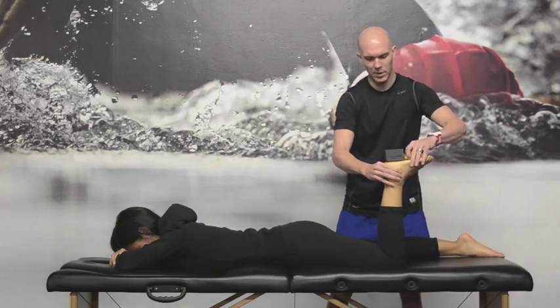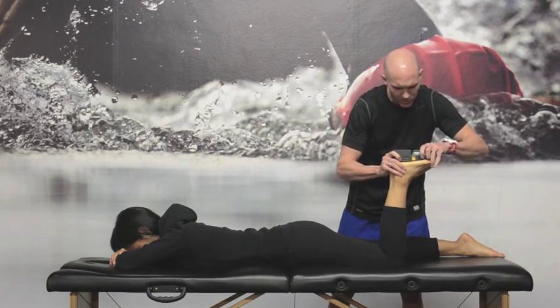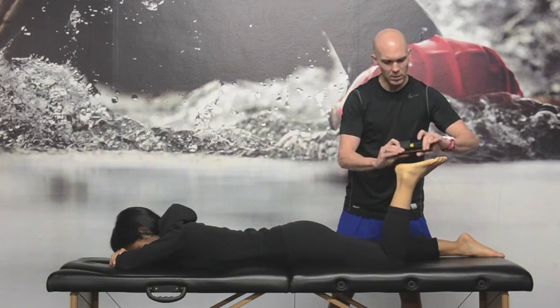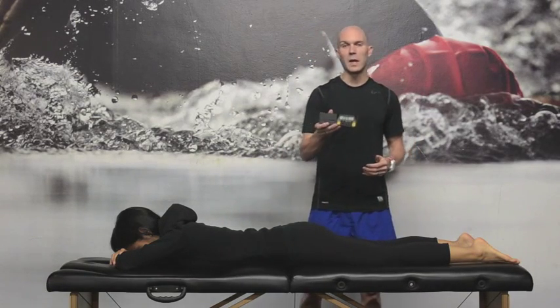Passively bring her up again, get it to what appears to be level, and repeat the same measurement. 28.9. So you can see, in this case, good intra-rater reliability.